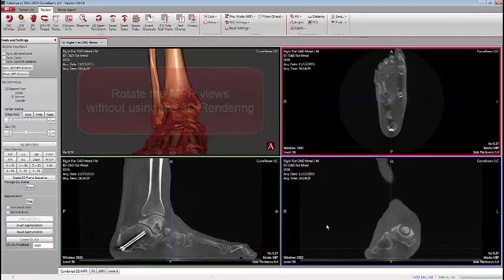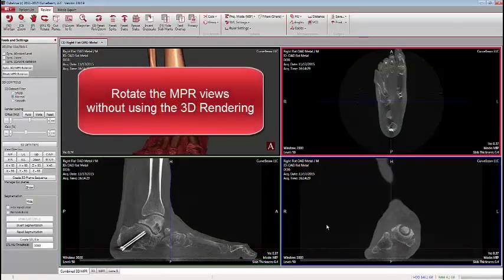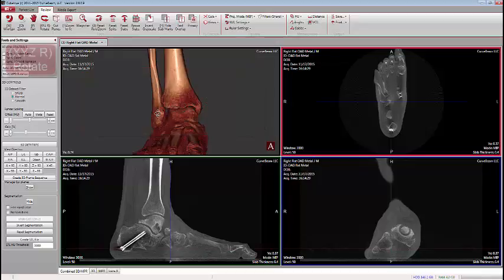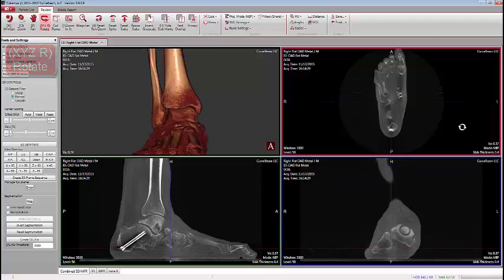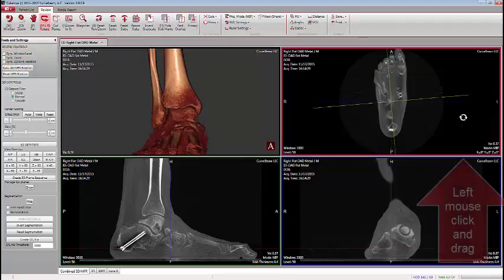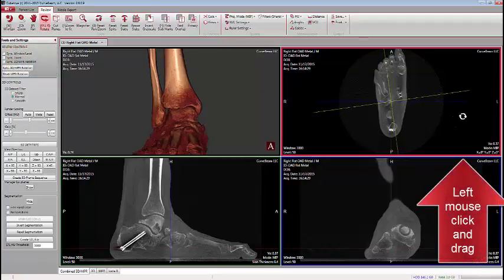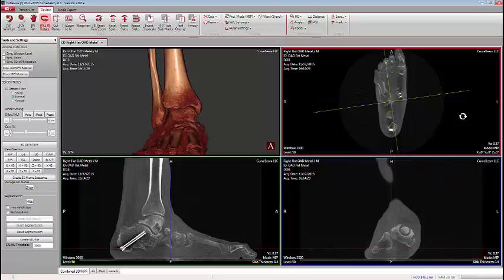Another new feature in CubeVue 2.8.0.9 is the ability to change the viewing angle in the MPR windows without going through the 3D rendering. Simply go to the upper left corner and click on the XYZ Rotate button. Notice how the mouse has now changed shape. Left click and as you drag, some lines appear that will enable you to better line up your viewing angles with respect to particular pieces of anatomy of interest.